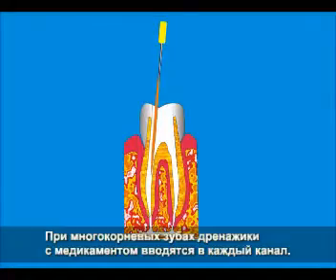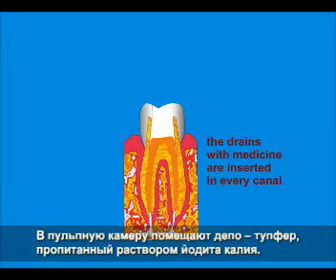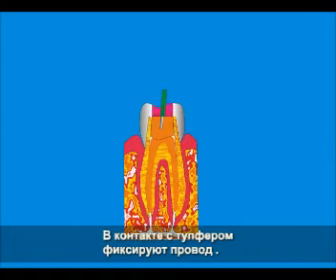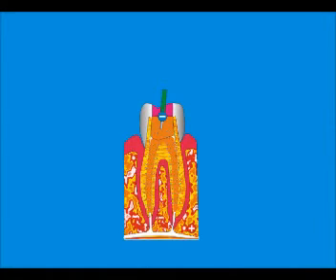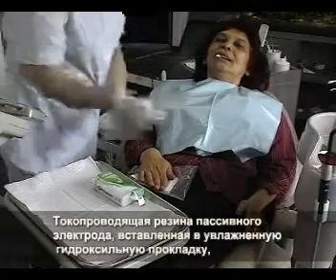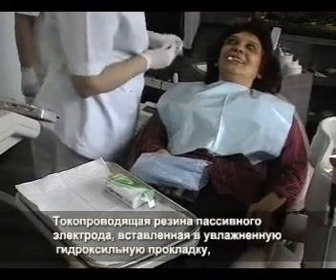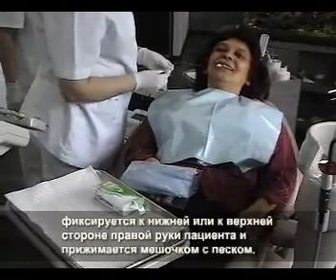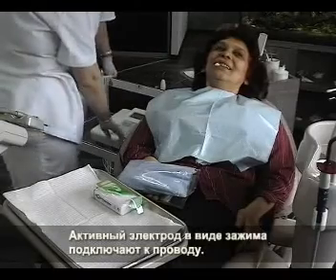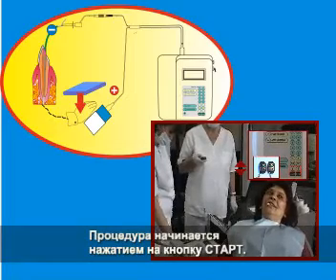For multiple-root teeth, drains with medicine are inserted in every canal, and in the pulp cavity a tampon soaked with the same solution is placed. The conductor is fixed in contact with the tampon. The patient is positioned in a comfortable lying position. The passive electrode — a conductive rubber placed in a wet hydroxylic bag — is fixed below or over the patient's right hand and pressed down by a sand pillow. The active electrode clip is switched on to the conductor.